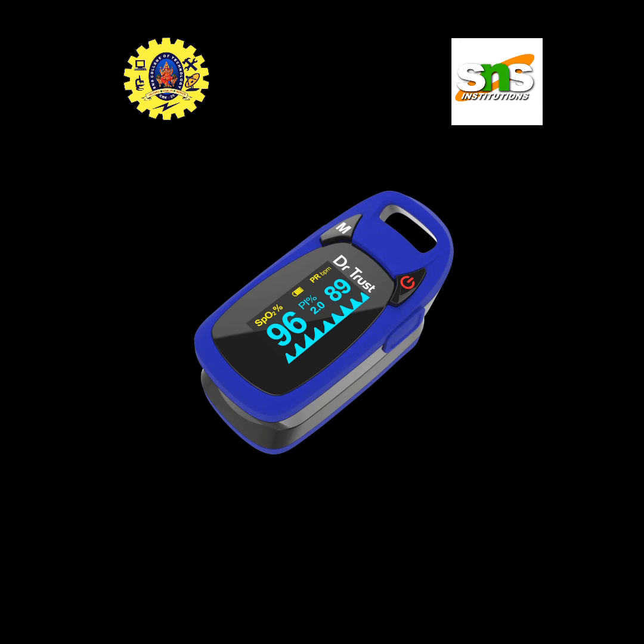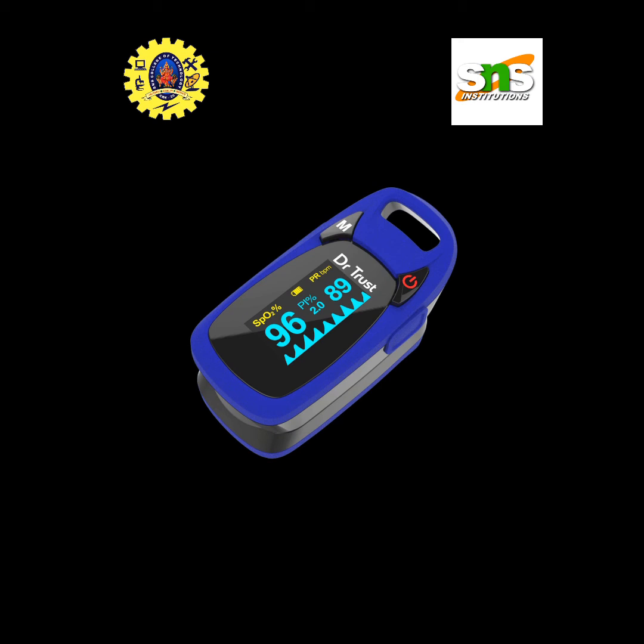The internal circuits and the processing components of the pulse oximeter do some calculations as well. The device has to compensate for the ambient light, finger size and absorbance of the rest of the tissue. There is a reference curve saved in the memory of the device to calculate the incoming readings and normalize them. This increases the precision of the results that it provides.